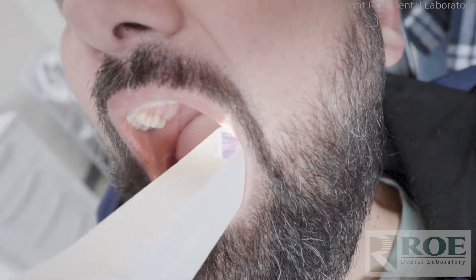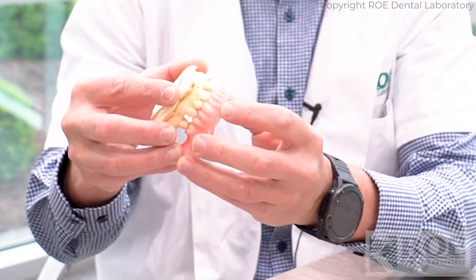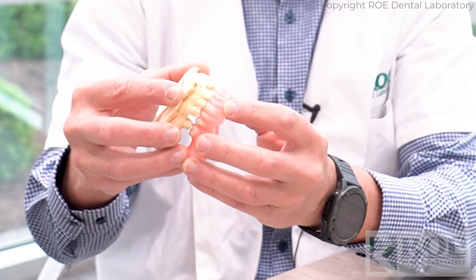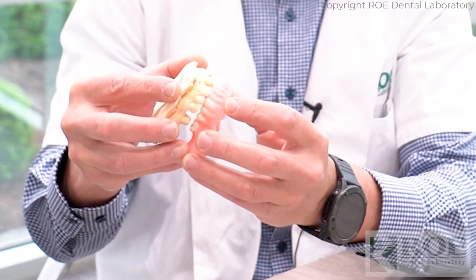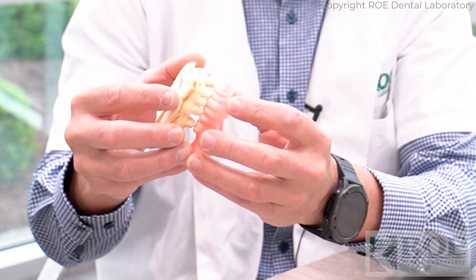Then scan the opposing arch and scan the bite. If you have a method — digitally or analog — to open the patient up to where you'd like them to be for the immediate denture, please do so intraorally or on the cast outside the mouth, scan that way, and we can make you a very predictable STL file for in-office printing.